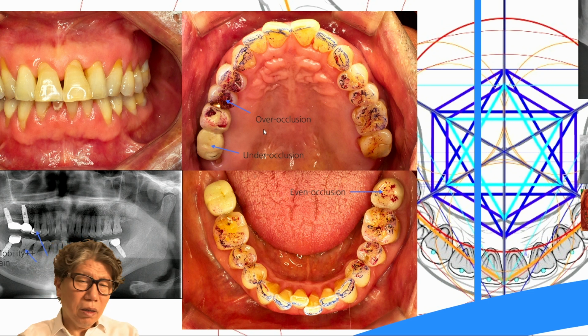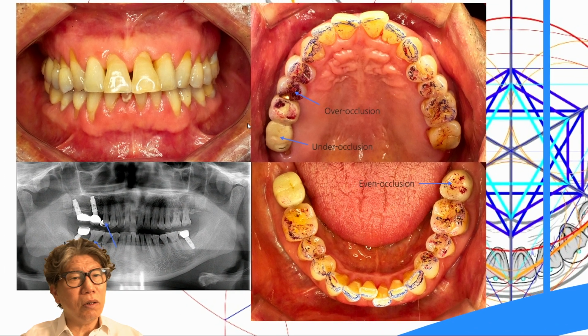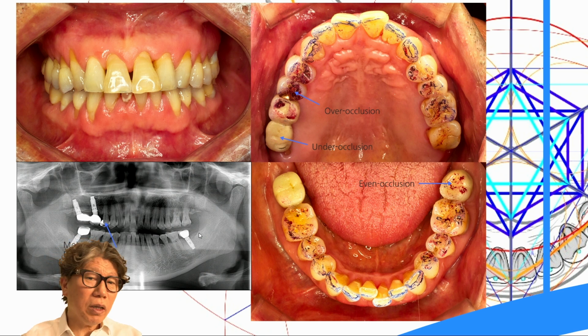In my case, I see a lot of patients like this. When they come, how should we resolve it? Piece by piece as you proceed, it results in a full mouth placement, with all 28 implants inserted.